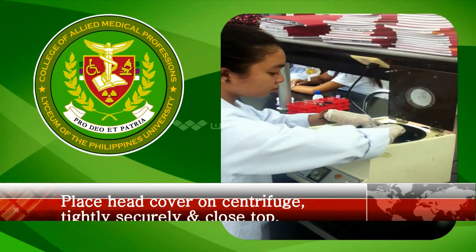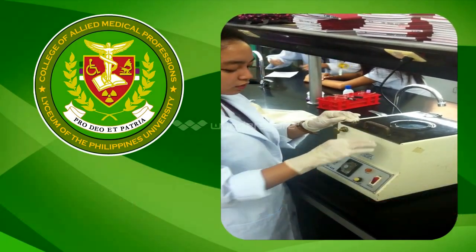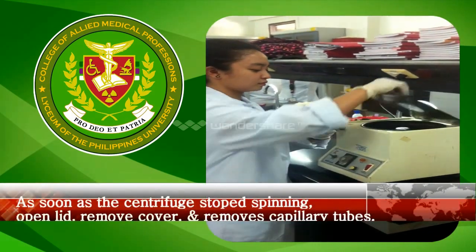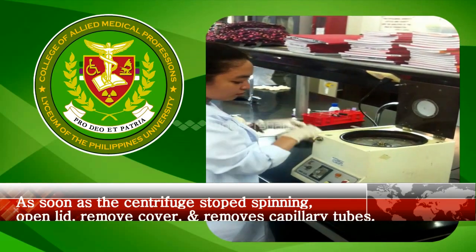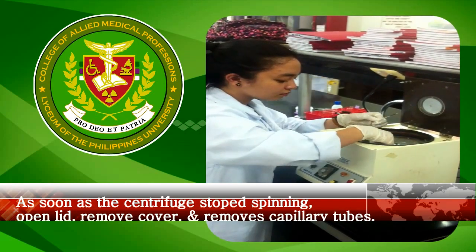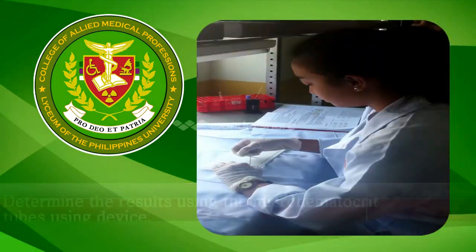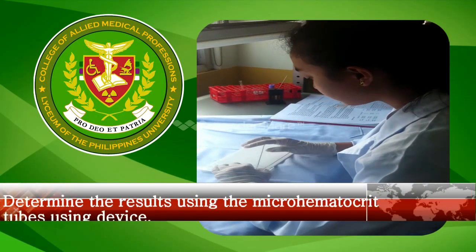Place the head cover on the centrifuge. Tighten securely and close the top. Centrifuge for 5 minutes. As soon as the centrifuge has stopped spinning, open the lid, remove the cover, and remove the capillary tubes. Determine the results using the microhematocrit tube reading device.